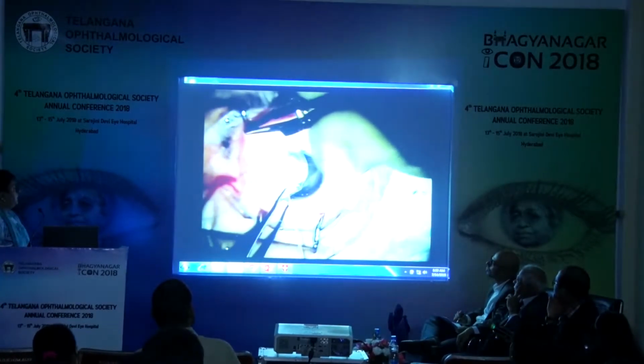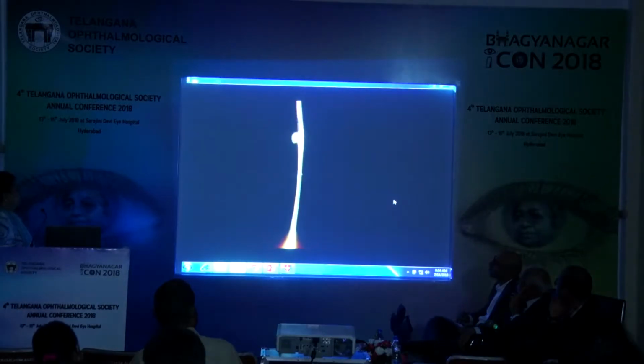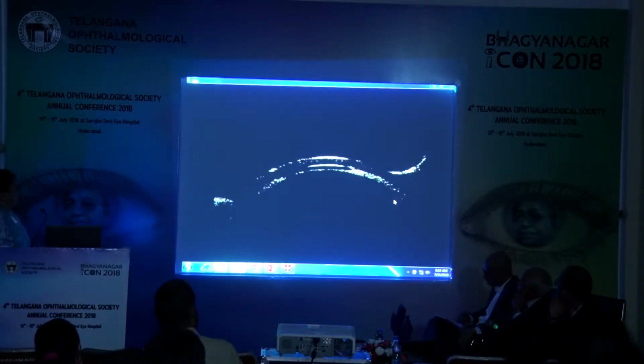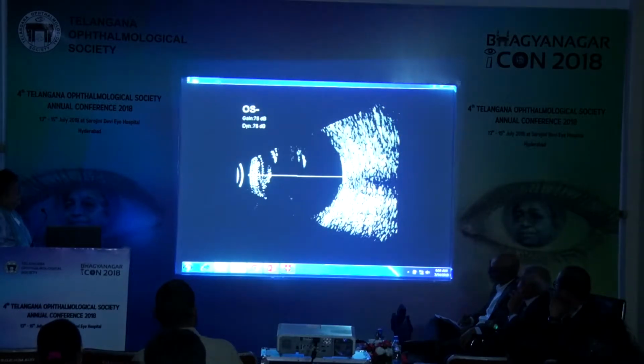elsewhere. She presented 6 weeks after pars plana vitrectomy with a flat anterior chamber, corneal edema with folds in Descemet's, pigmentary membrane over the pupil, tube barely visible in AC, and 2 patent PIs with an IOP of 26 mm mercury on 3 anti-glaucoma medications. There was no view of the fundus, and choroidal detachment was excluded with a B scan.